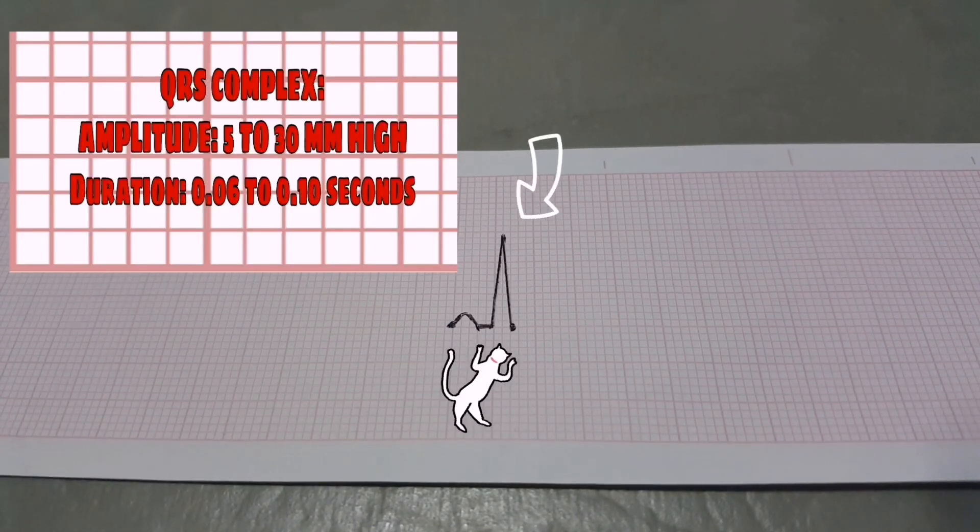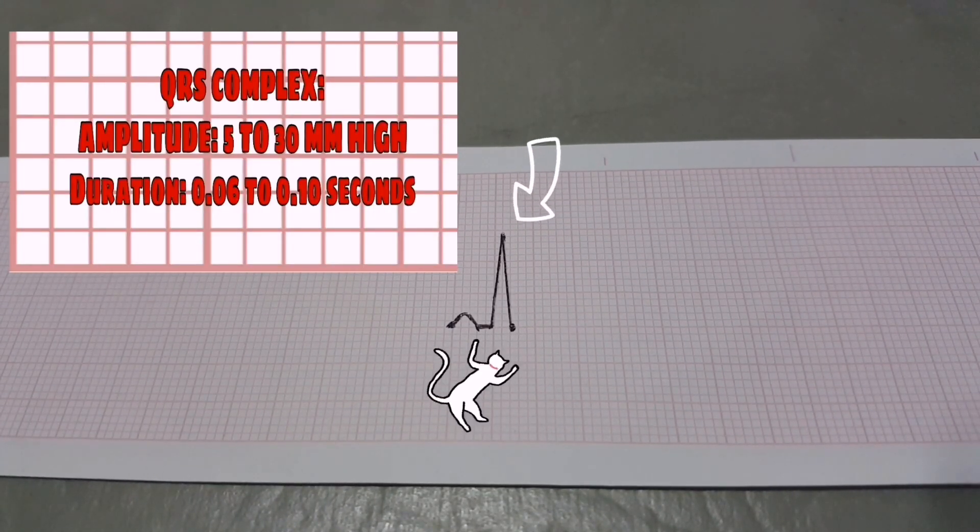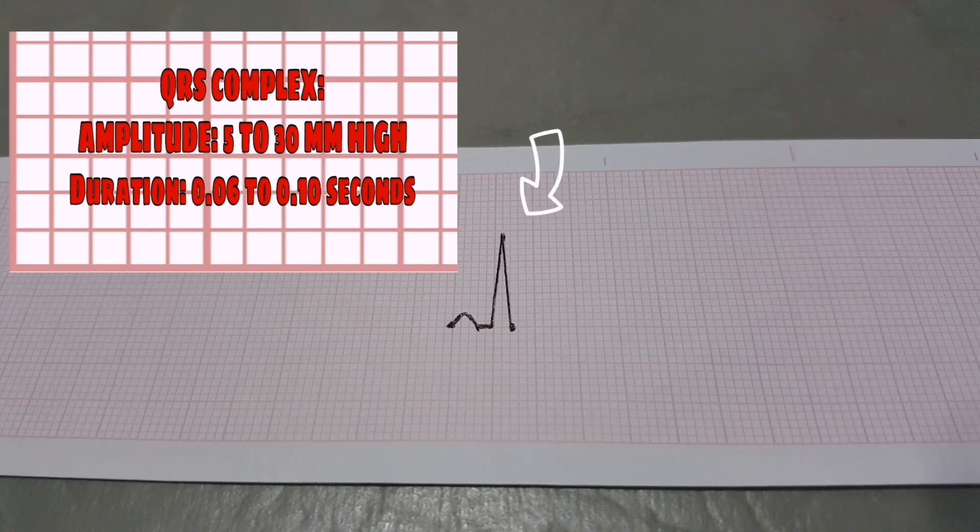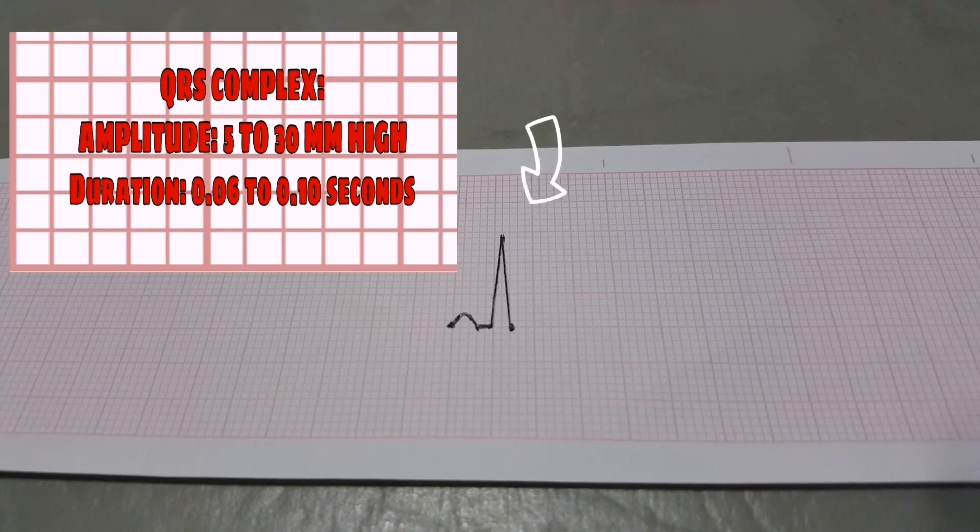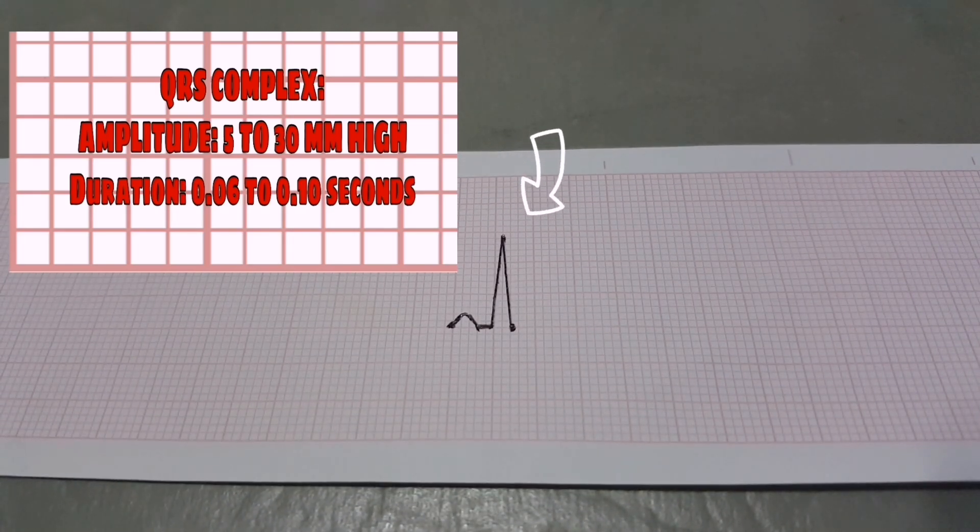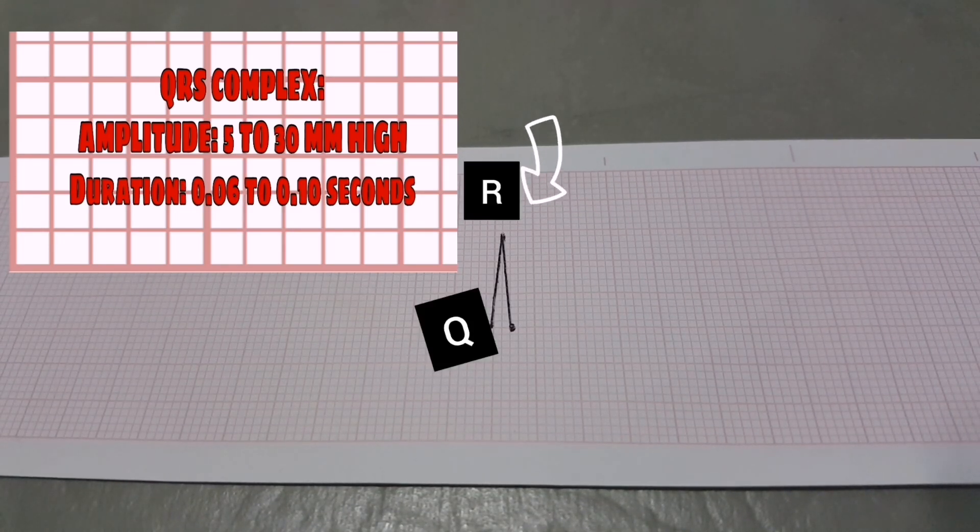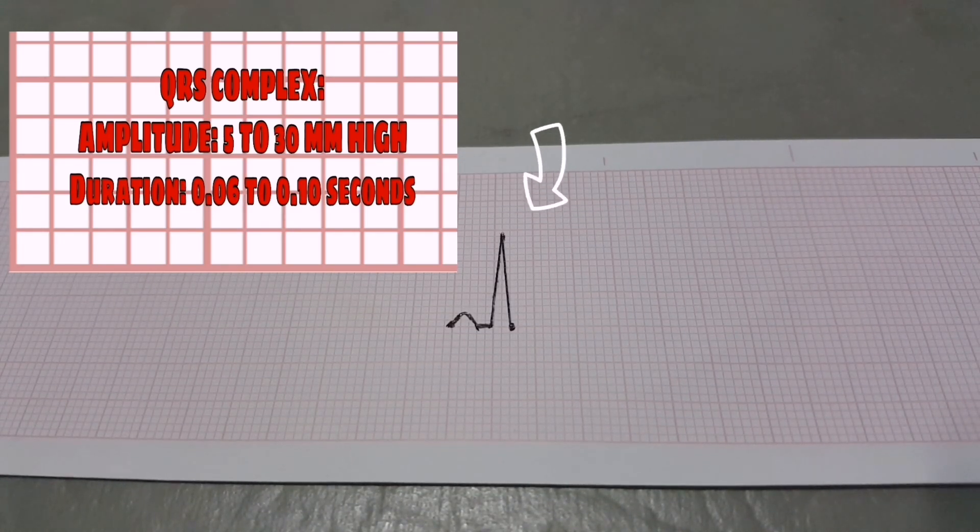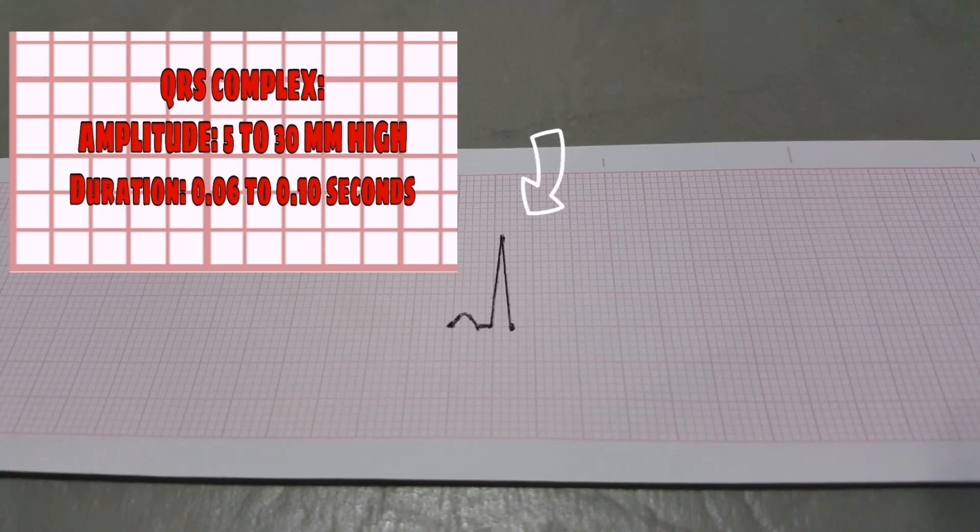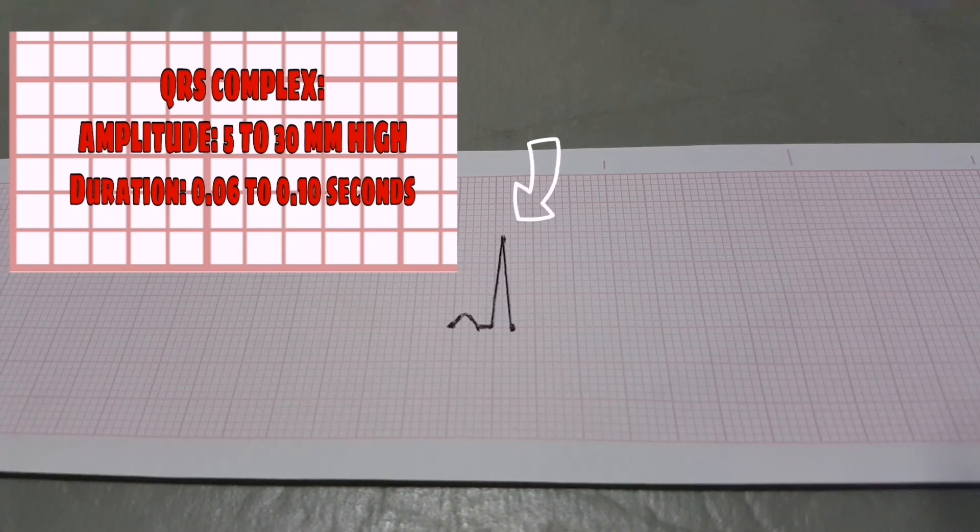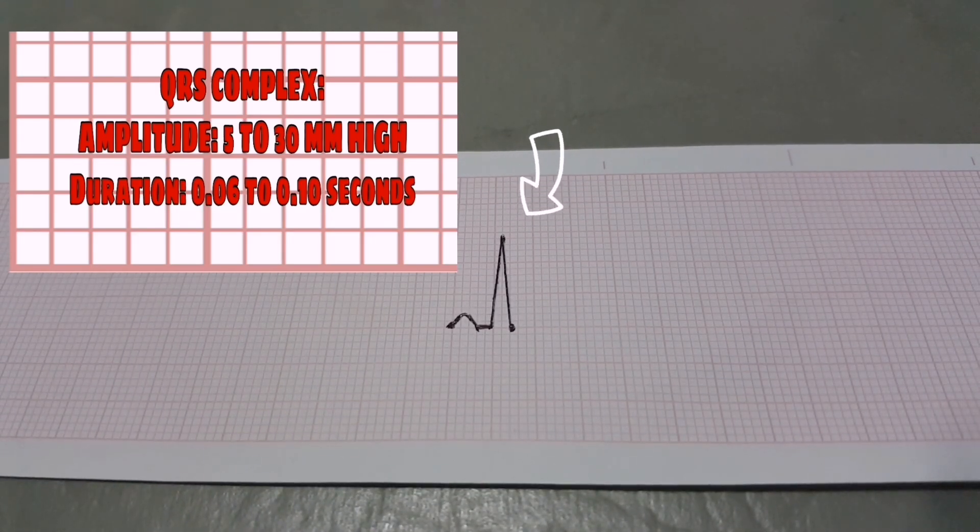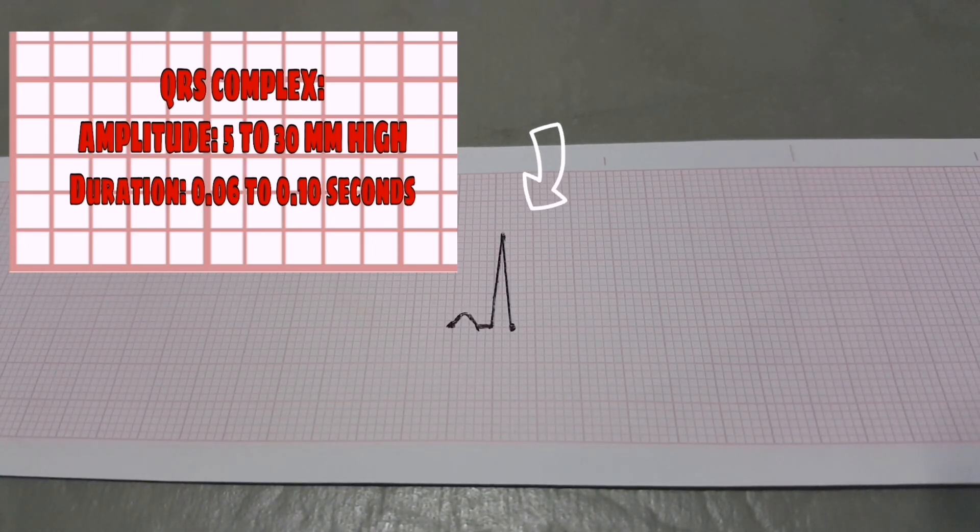The QRS complex represents ventricular depolarization. It follows PR interval, amplitude 5 to 30 millimeter high. Duration, 0.06 to 0.10 seconds. Configuration, there is a Q-wave, an R-wave, and an S-wave. Deflection, it is positive and or upright in leads 1, 2, 3, AVF, AVL, and V4 to V6, and negative in V1 to V3.